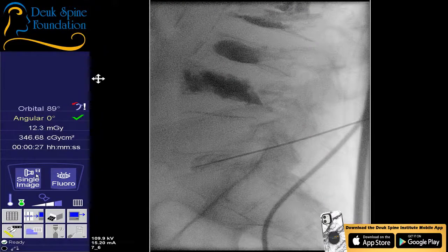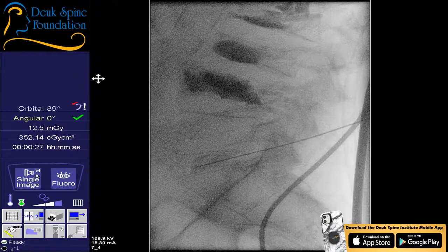So what I've done, folks, is I've injected into L5-S1 some dye, which you visualized on a lateral x-ray. There's really not a big tear, so I think mostly what we're dealing with is a condition called internal disc disruption, IDD. It's not common, but it's a condition where you don't really have a big tear, but the inside of the disc has been damaged and kind of partially healed itself, but it's still painful. We're going to make our incision.